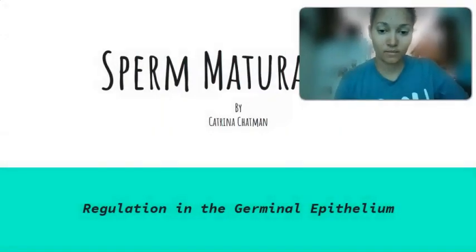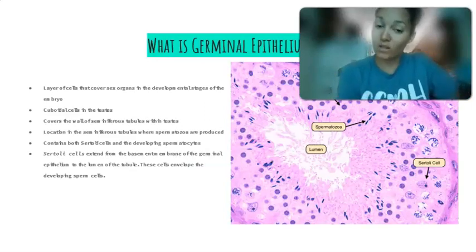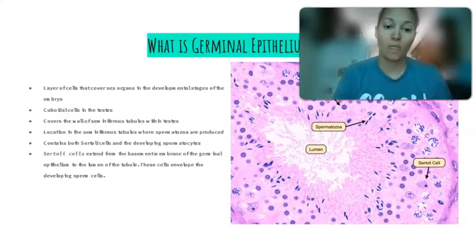Today we are going to be discussing sperm maturation and sperm development. First, we're going to start off by discussing germinal epithelium. What is germinal epithelium? Here, I have a beautiful histological slide of germinal epithelium. We're going to discuss what each section is.